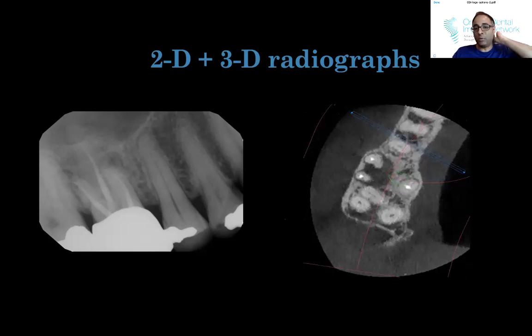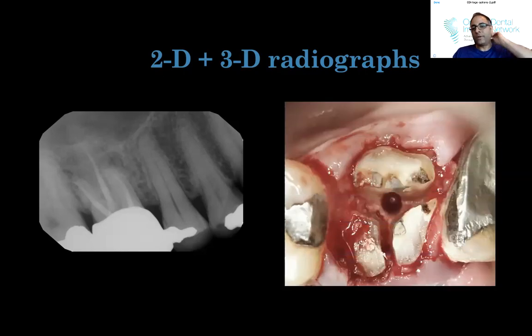We did an immediate molar as well with an indirect sinus lift at the same time. So that's what it looks like. And you'll see when we section the roots before I do my sinus lifting, in preparation for the sinus lifting, this tells me I'm going to section them in three.